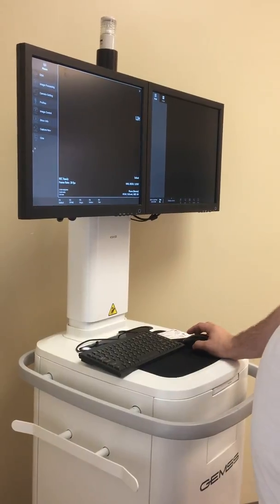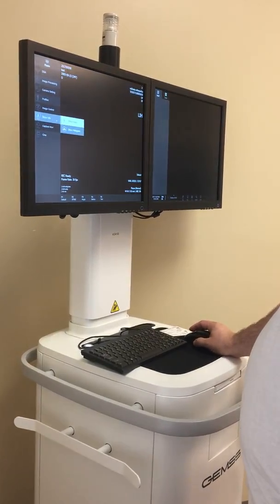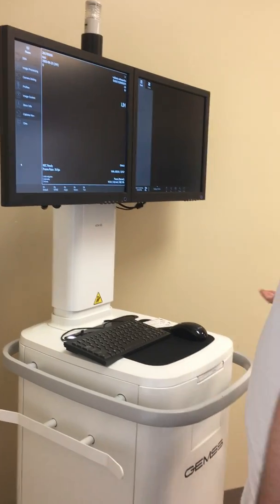Alright, and there's our study. I think I have... and it's all the same.